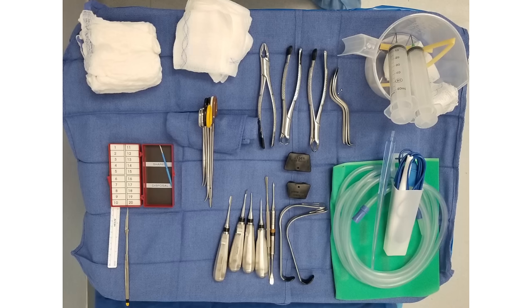Okay, next are some dental extraction forceps. This is a straight one I don't use too often.